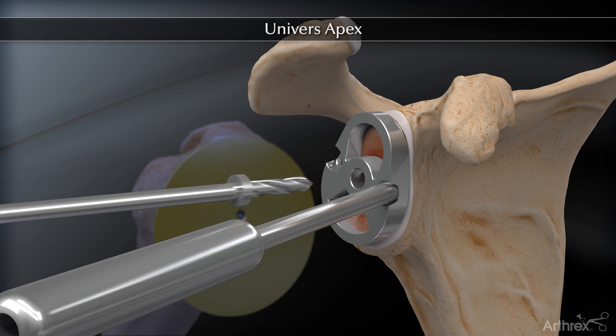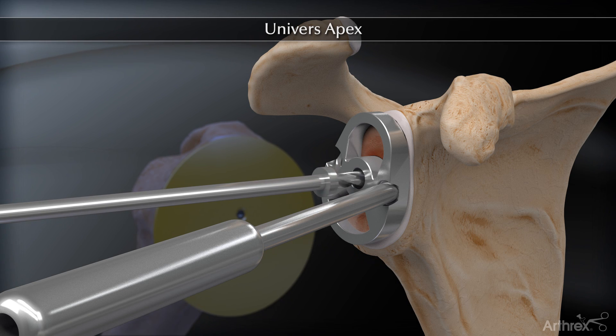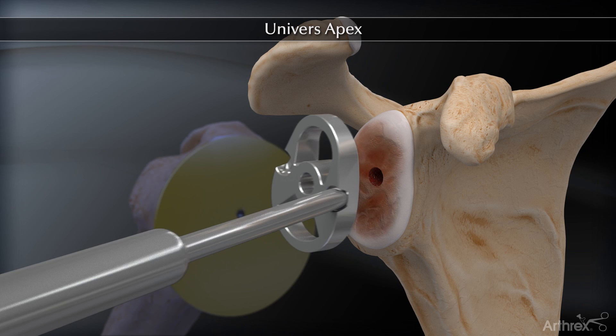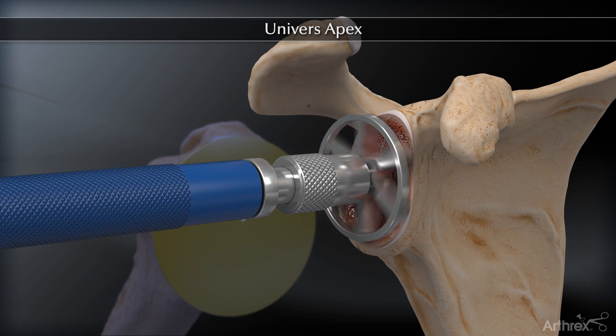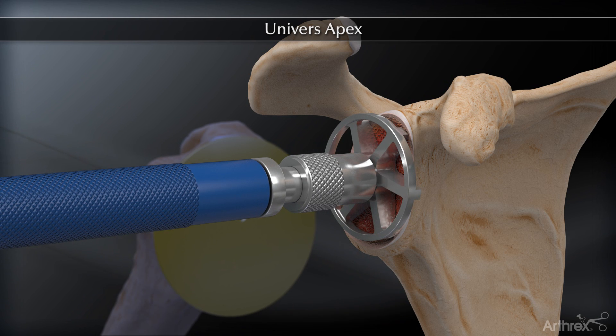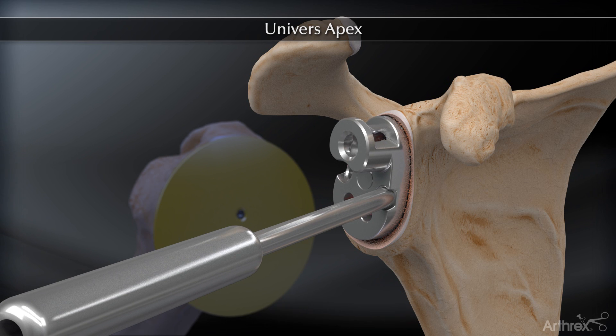The appropriately sized glenoid reamer is positioned by placing the reamer peg in the central hole. The glenoid surface is then contoured to support the polyethylene component. The number two glenoid guide is positioned by placing the central peg into the previously drilled hole.